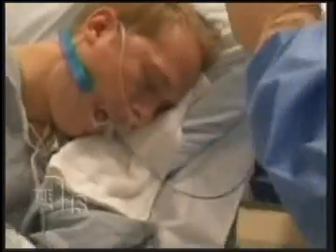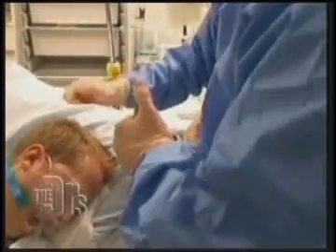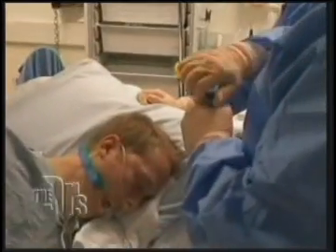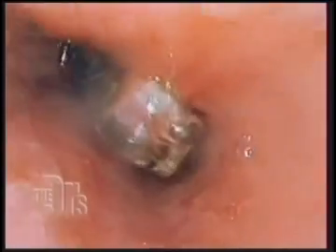So now that it is safely in place, we take the safety cap off, we press down for 5 seconds, and then we dislodge. Done. There are the vocal cords. And there is the Bravo chip, right there in front of us. Perfect, that's beautiful placement. All right, so that little microchip is going to be transmitting pH information for the next 48 hours.